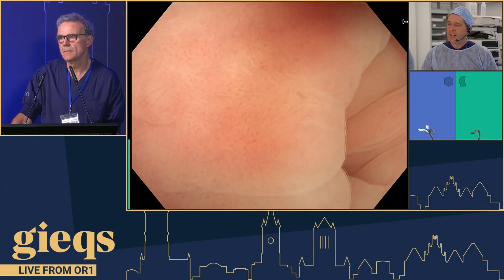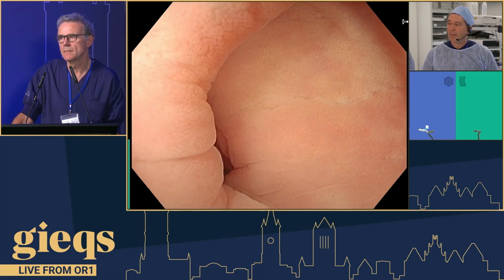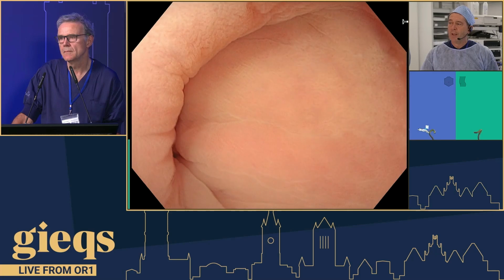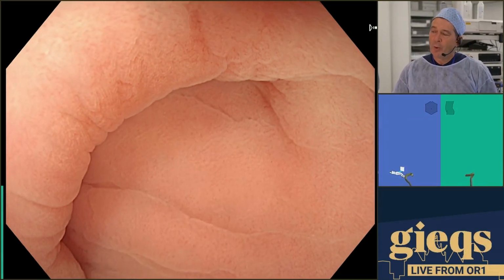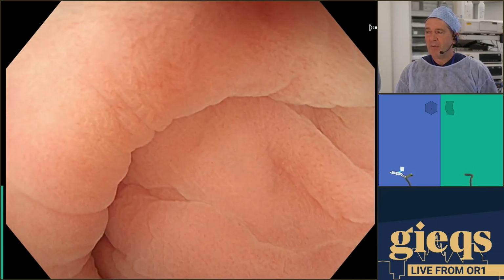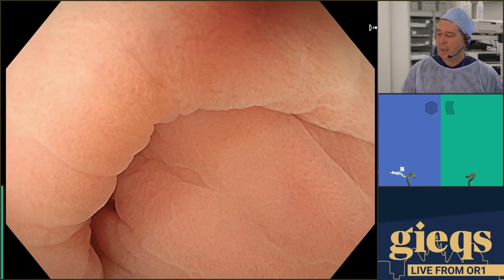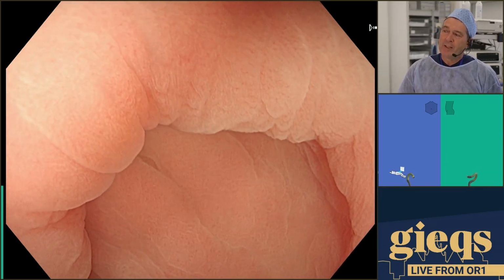But then I think it's imperative in this sort of colon that you then pleat the colon. Having got around the corner, we're going to just allow the scope to straighten itself up, and you do that by some gentle traction. We're not quite round this corner. The other thing running through my mind as I'm doing this is, if it's a really redundant colon, whilst the left lateral is ideal for water immersion on the left colon, gravity is affecting the loops.